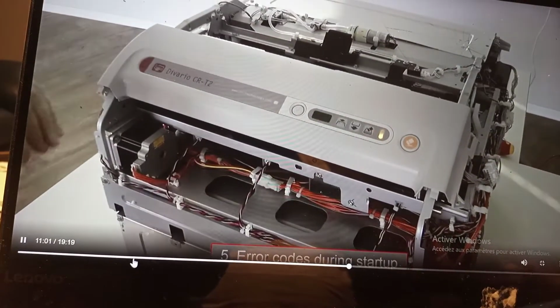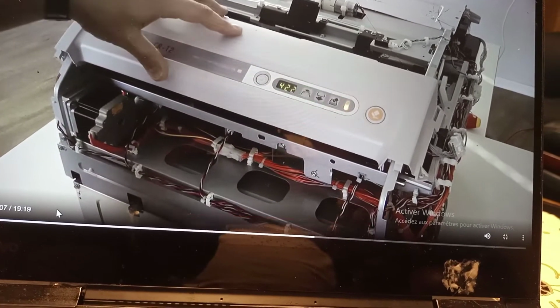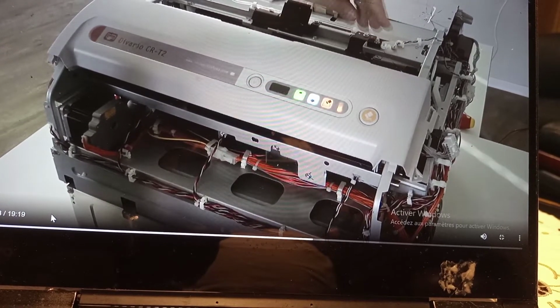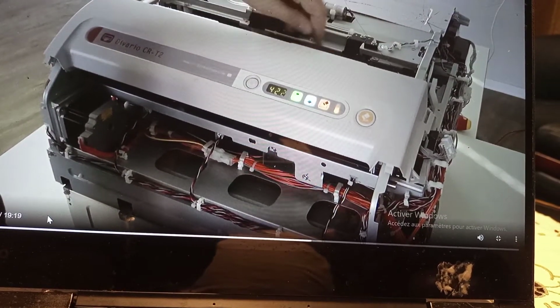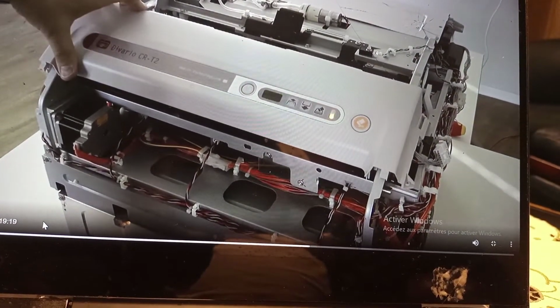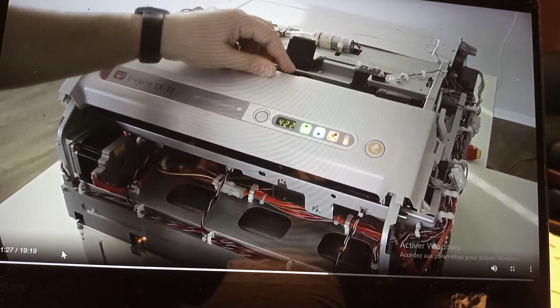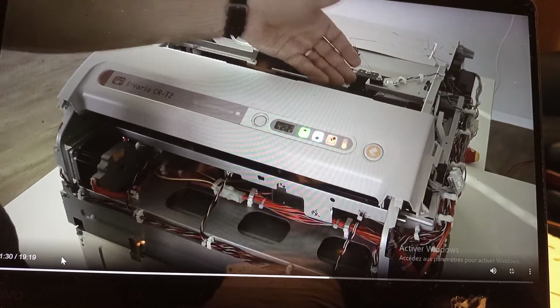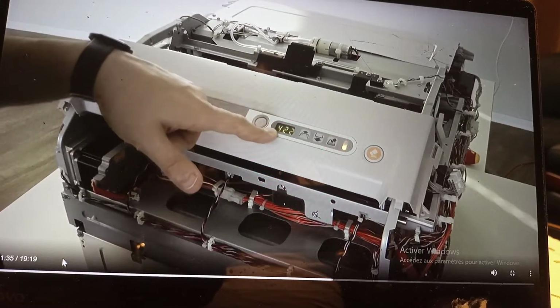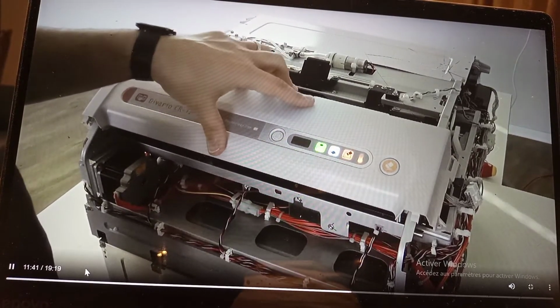So now I just want to show one case when the device is not starting correctly during boot up. So I disconnected this sensor. The sensor is for detecting if the image plate is pulled from the cassette out in the conveyance unit. During boot up it makes some tests, and after some tests it's not detecting an image plate in the device, and also this sensor is not connected, it gives me an error code. In this case 422 means the image plate is not recognized, maybe dropped.